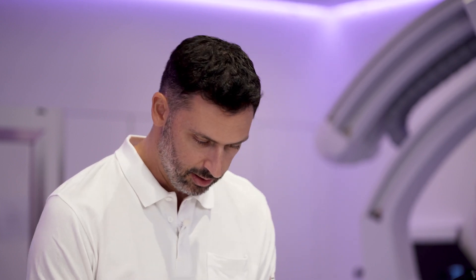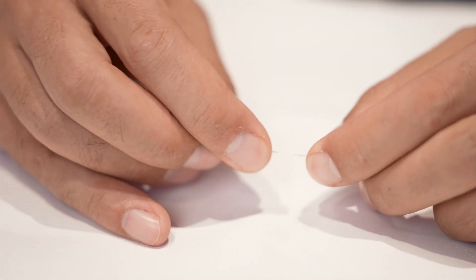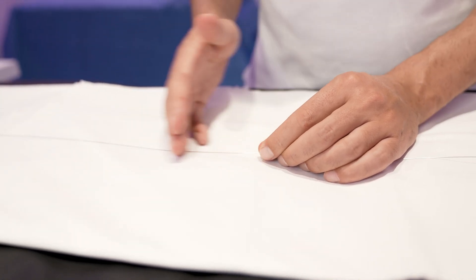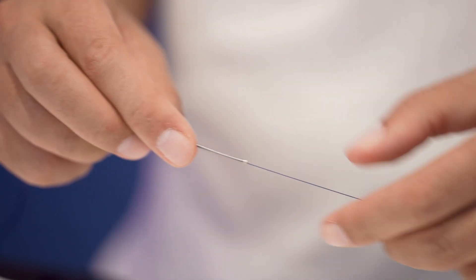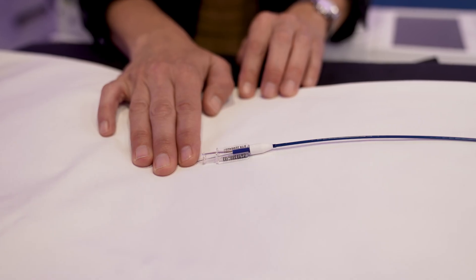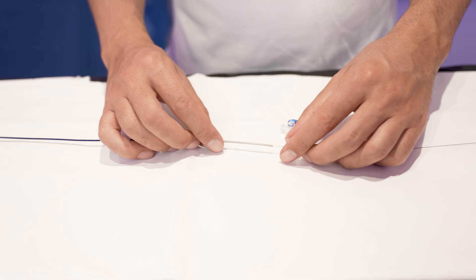That's exactly why we need this extension wire. As you can see, I can now extend my 2-meter stent retriever wire to 3 meters and 15 centimeters using this extension wire. Now it's connected, and it's actually pretty smooth, so even now you can advance other devices over it. The big advantage is that now I can introduce my aspiration catheter over the extension wire, and I'll ask my assistant to hold the end of the wire.